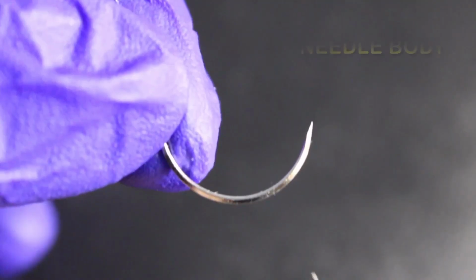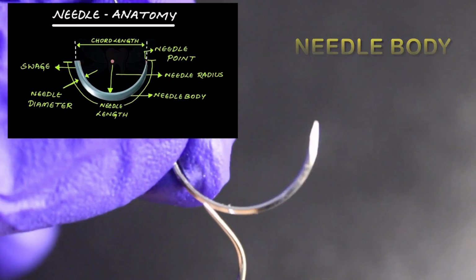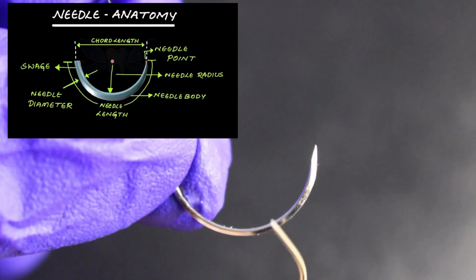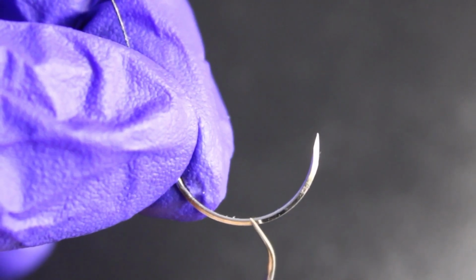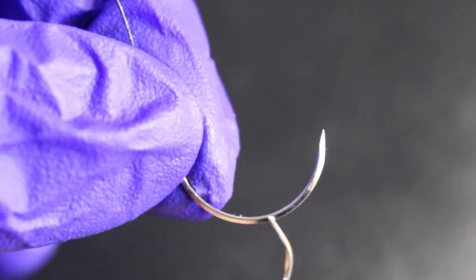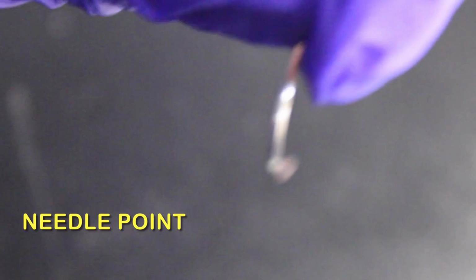Next, moving along, we have the needle body. This is the widest part of the needle and it is often referred to as the grasping area because this is where you hold the needle with your needle holder. Now, the body of the needle comes in various shapes. It can be round, oval, rectangular, trapezoid, or even side flat, depending on the type of the tissue and the procedure.